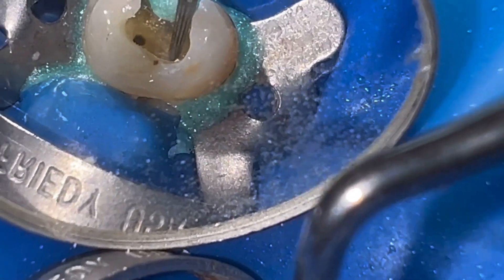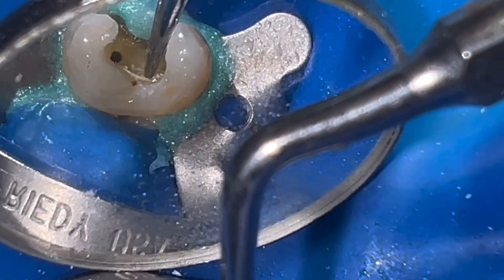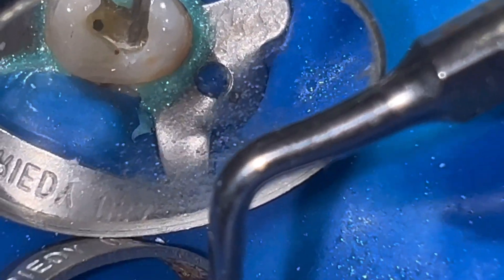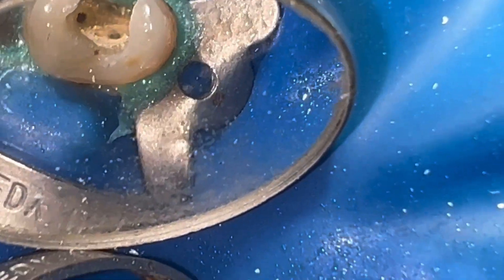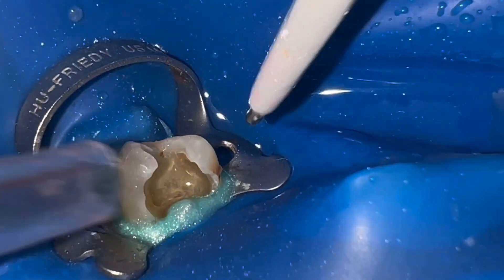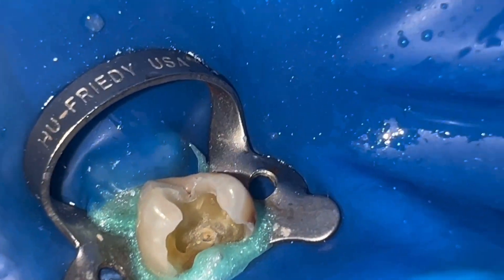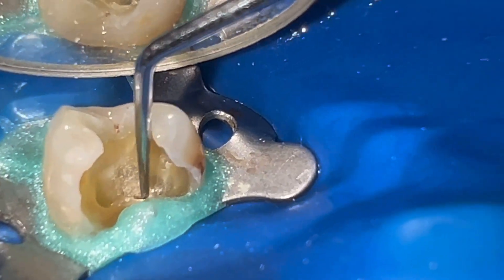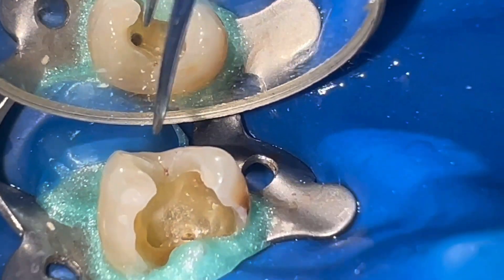To try to be more precise we use ultrasound tips — in this case one of my favorites, the Woodpecker Z18. Once we clean the pulp chamber with water, we use a sharp endodontic explorer to locate the palatal canal.